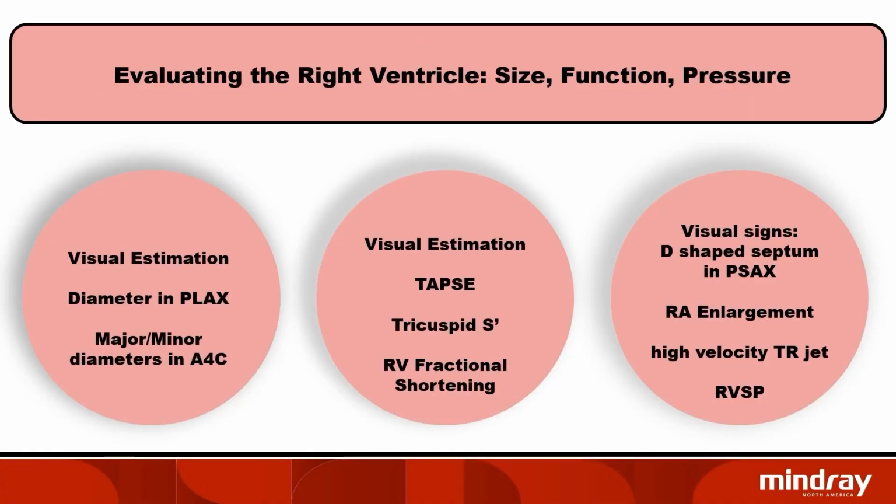Finally, when assessing shortness of breath, you have to think about the right side. Evaluation centers around looking at size, function, and pressure, and ultrasound can help you better understand all of these. Now, let's hear from the experts.